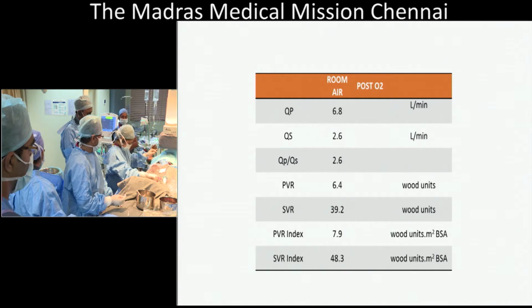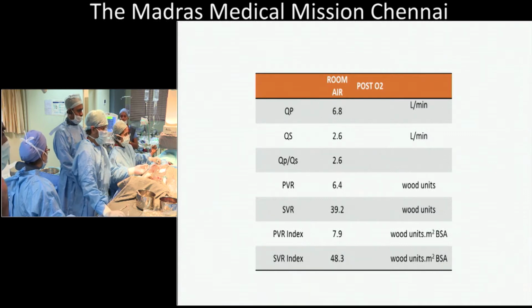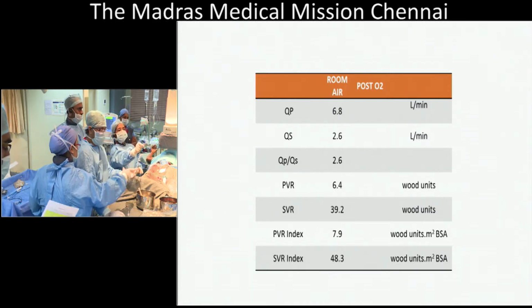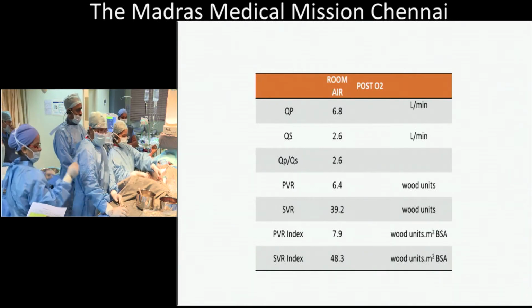Okay. Dietmar, is that what you would do as well? For me, it's a clear indication to make a fenestrated ASD occluder. But you would go straight for closure. Yes, you wouldn't do anything else. Fenestrated. And Nick? I would go for a fenestrated ASD occluder. Yes. Zaid? I think this is something to discuss.